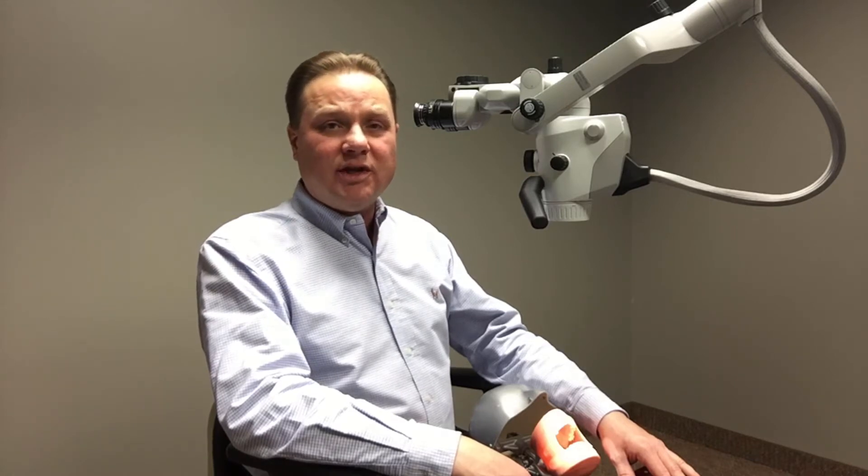Before I get into those, I'd like to take a moment and review a couple of ergonomic principles that we would like our doctors to achieve, to reduce the fatigue and the body strains that can present themselves after many long hours of working in a static position, especially if you're using a microscope that cannot get you in good ideal working positions.